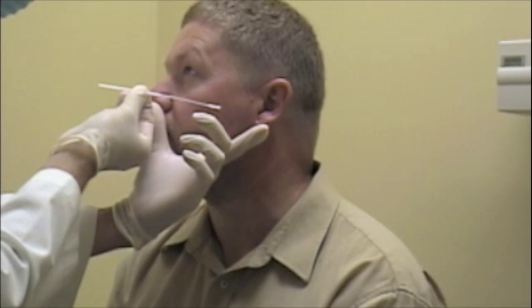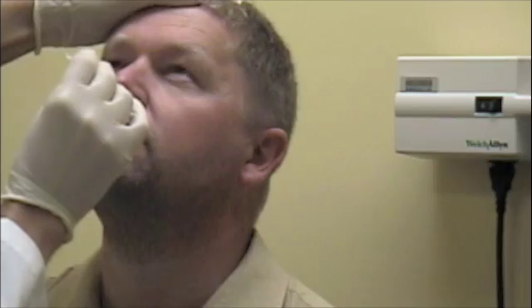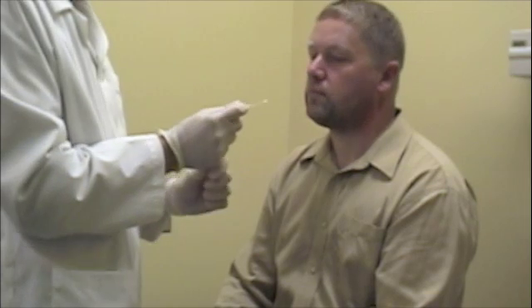Estimate the distance by measuring from the corner of the nose to the tip of the ear. It is important to insert the swab only one-half to two-thirds this distance. With the patient seated and head tilted slightly back, insert the swab along the base of the nose and along the medial septum. If resistance is encountered, rotate the swab slightly or try the other nostril. When you reach your pre-measured distance, rotate the swab to dislodge epithelial cells before withdrawing it from the nose.